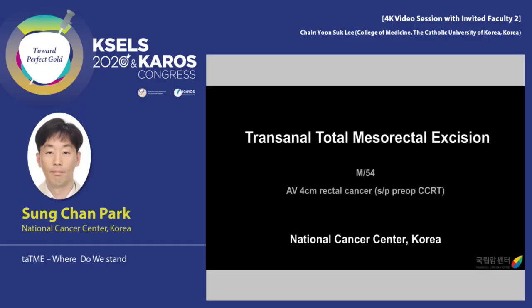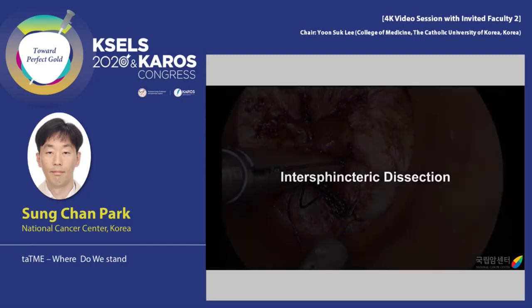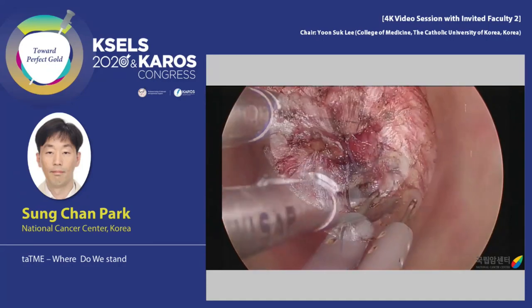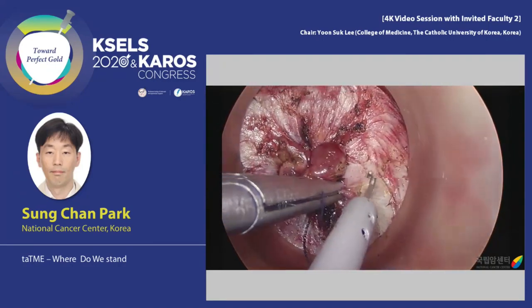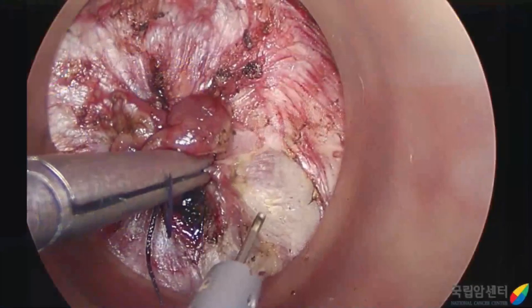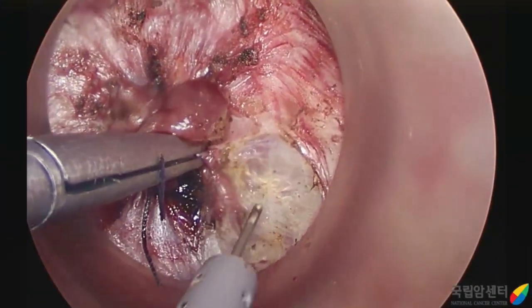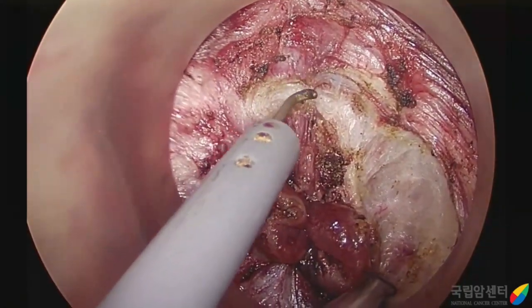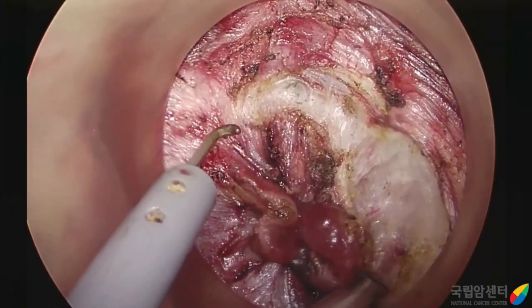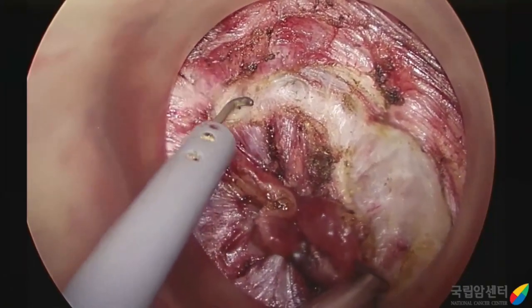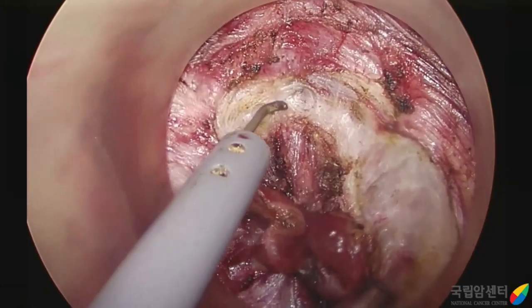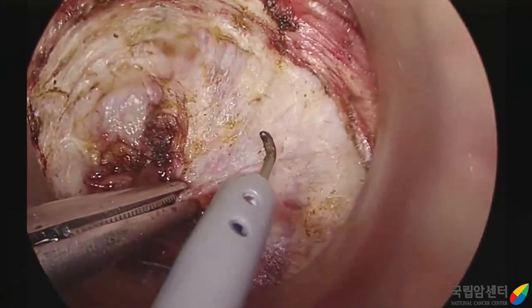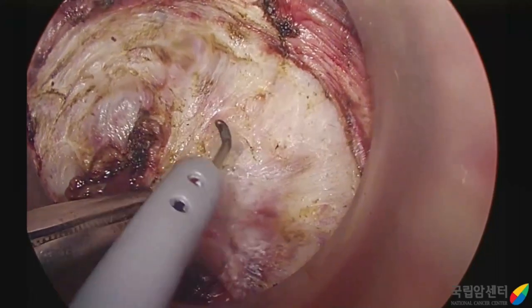This video is about transanal TME in the patient with rectal cancer after preoperative CRT. Because of low-lying tumor, we made a purstring suture before initiation of transanal dissection. Secure purstring suture is very important, and it must be durable and airtight to avoid contamination and tumor cell spillage during the procedure.